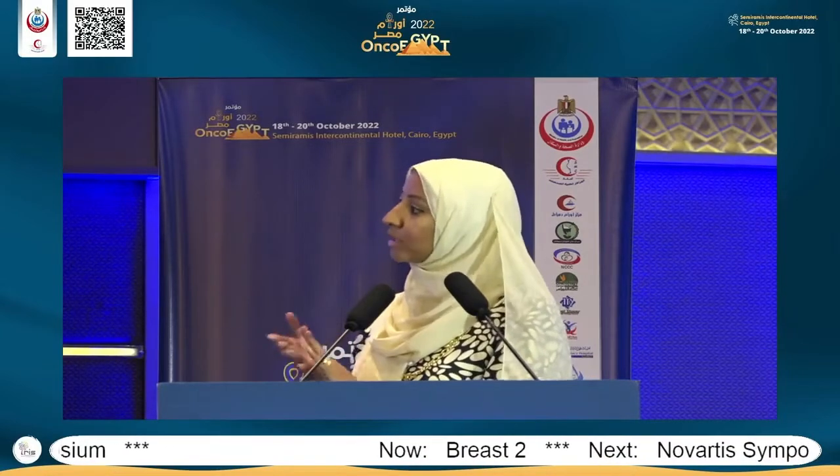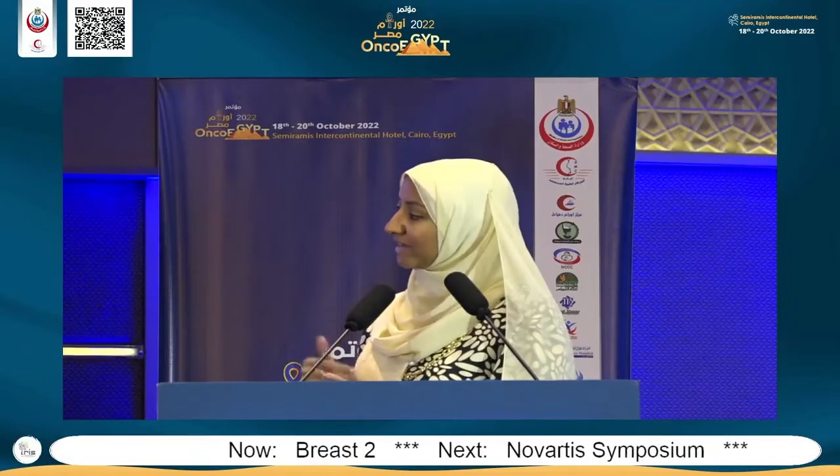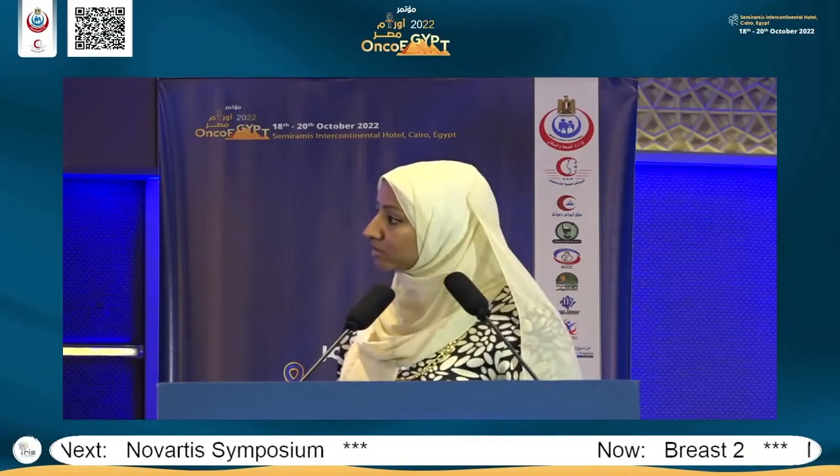في lesions أوكي، يعني أنا دلوقتي فكرة إن أنا باقلل مثلًا إن أنا آخد biopsy من benign lesion. يعني أنا عندي lesion دلوقتي وأنا مش sure إذا كان دي مثلًا أحيانًا كتيرة بيبقى في fibroadenoma فيها نسبة شك، إن أنا أسحب منها biopsy. فالكونتراست انهانس ماموجرافي هيقلل العدد بتاع البيشنت عموما اللي انا اقدر اسحب منهم بايوبسي. فخلاص انا عملت لها كونتراست، ودي مثلا مش واخد انهانسمنت او واخد باترن انهانسمنت بتاع بناين ليجن، فخلاص نوت نيد فور بايوبسي يعني.